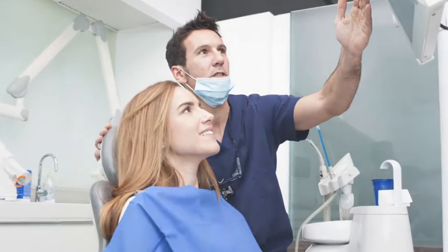the entire arch. Digital photography is also probably a tool that is better than the intraoral camera that many of us use. And the reason that I say that is it allows us to look at our patient with very clear images and allows them to see their whole mouth rather than focusing on single teeth.